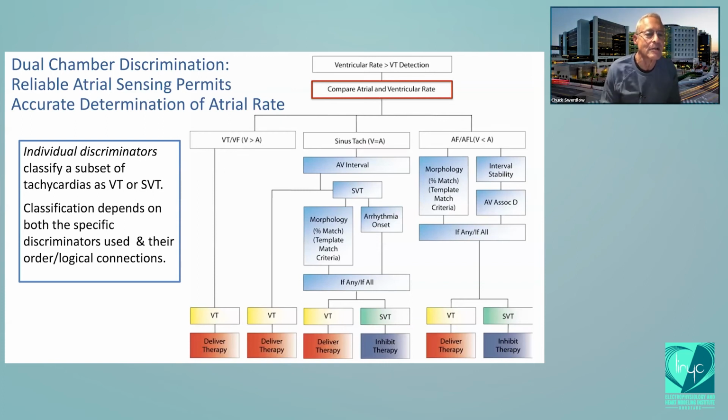get me started on that. I've written many memos about that in the last 20 years. Let me now turn from single chamber discrimination to dual chamber discrimination.